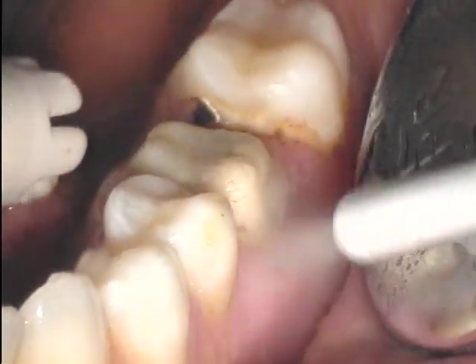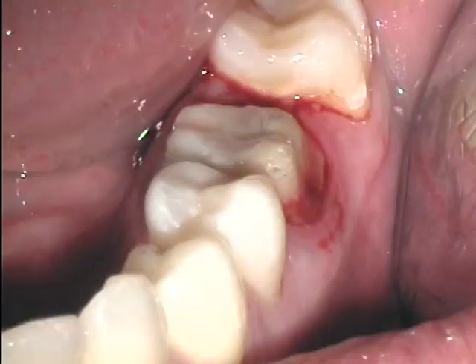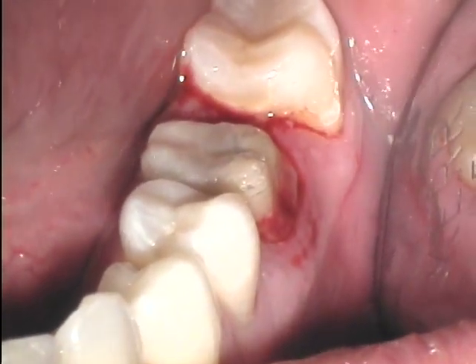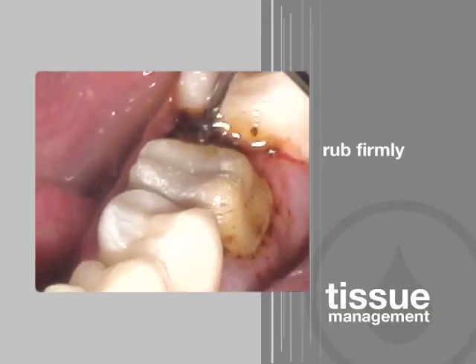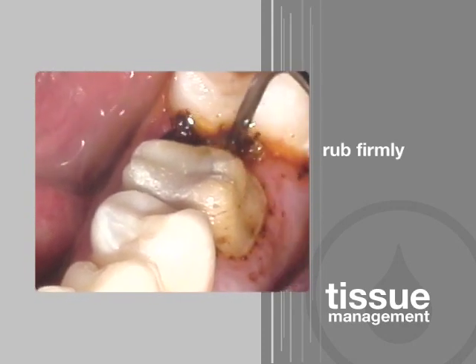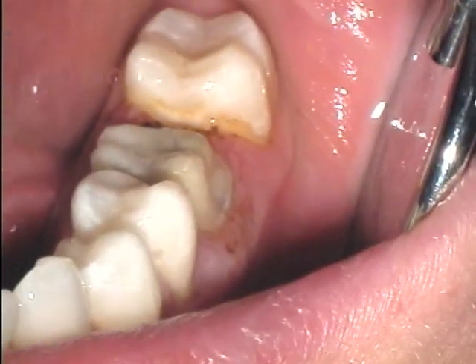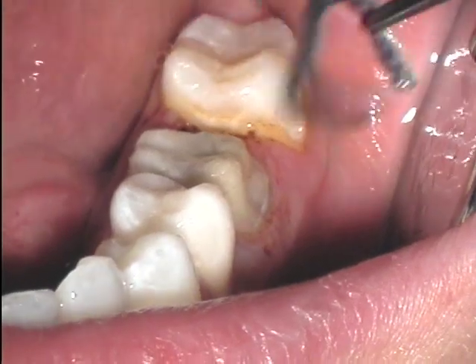To test for completeness of hemostasis, the sulcus is cleaned with a firm air-water spray. Remember, if bleeding is the tissue's response to a firm air-water spray, then bleeding will probably also occur during placement of the impression material. Therefore, if bleeding occurs, more Viscostat should be burnished firmly against the area. Once again, hemostasis is tested with a firm air-water spray. If no bleeding occurs, hemostasis has been achieved and we're ready to pack the cord.